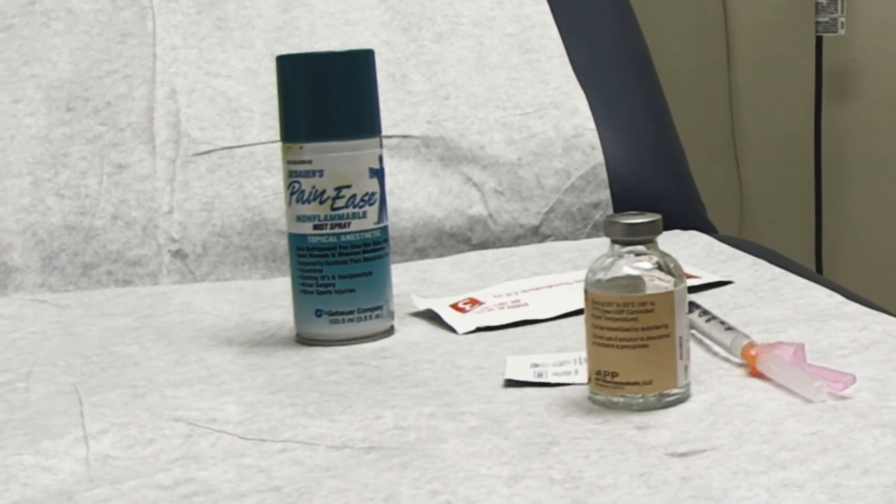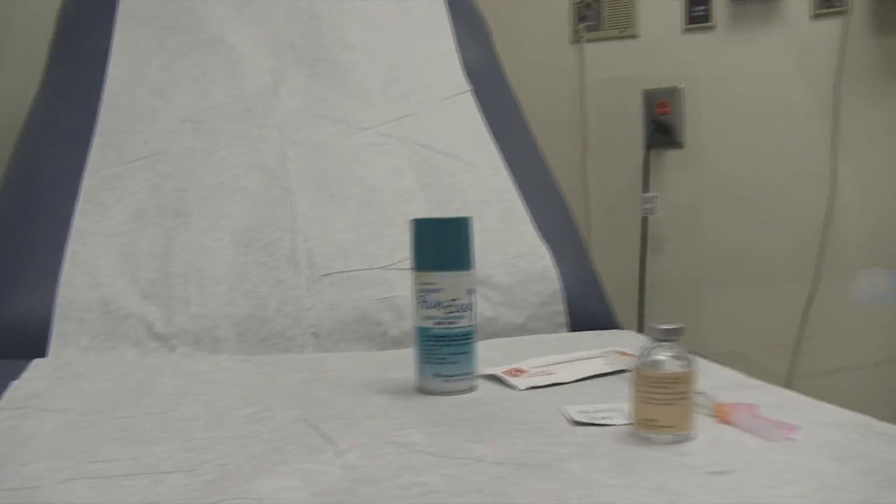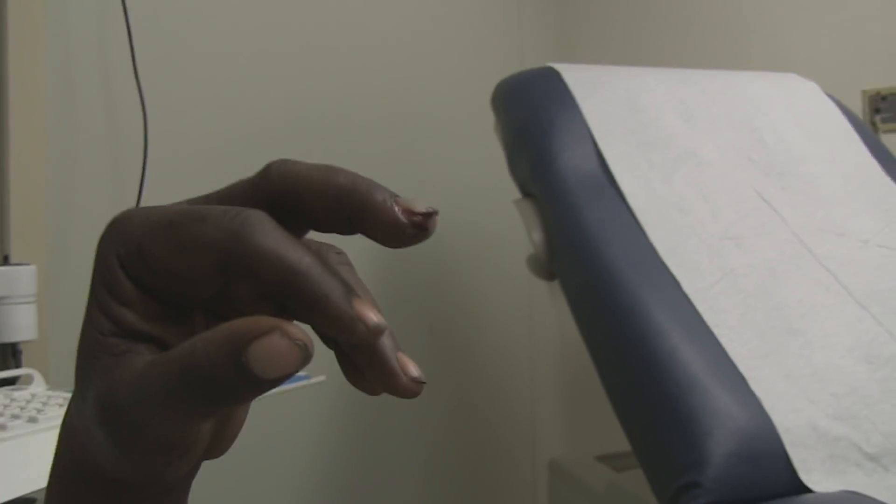We are going to do a procedure today on a dislocated finger and also we've got a subungual hematoma.